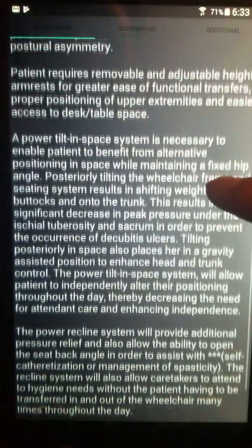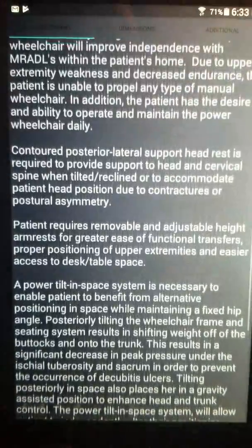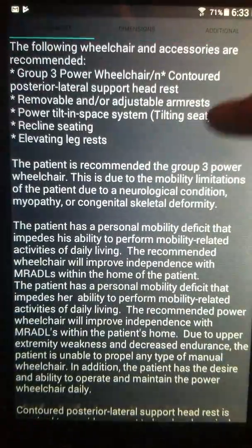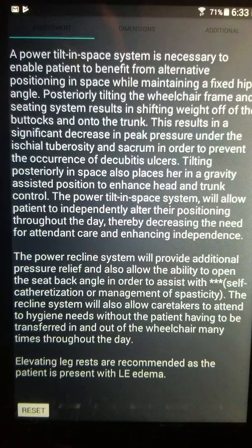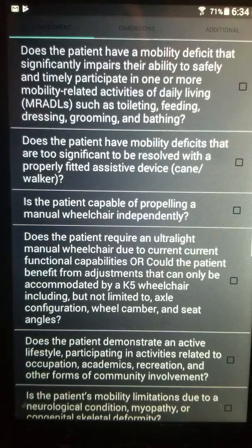Providers sometimes struggle with justifying or helping to justify DME or any type of equipment. So basically it just gives you that, and then you are good to go. Obviously, you have a conversation with the vendor and use your clinical reasoning. This does not replace it, and you can always just reset it if you do make an error.